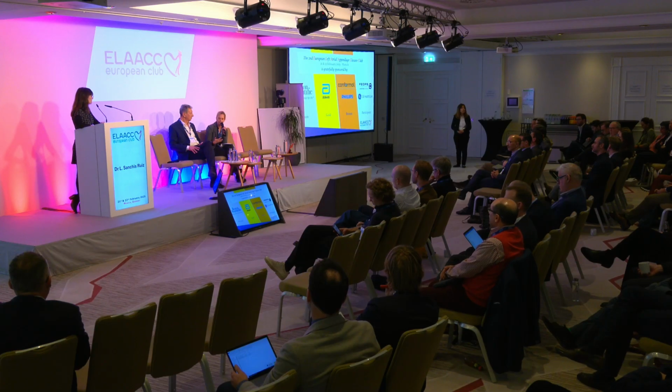But there's one thing missing: you don't have the small wheel, which brings you to the right and the left side. This is a movement you can't have with this probe. And if you want to have the probe maybe for mitral clip or mitral procedures, tricuspid procedures, it might be a limitation. So this might be a decision for an institution to go for a real TOE probe rather than going for a minimalistic approach. I think that Philips have the lateral wheel. I didn't test it, but I think they have it. But for appendages and for interatrial septum, I never use the lateral wheel. And we made some mitral clips, but I think that if you are getting the anesthesia, it's better to do it with the standard probe.